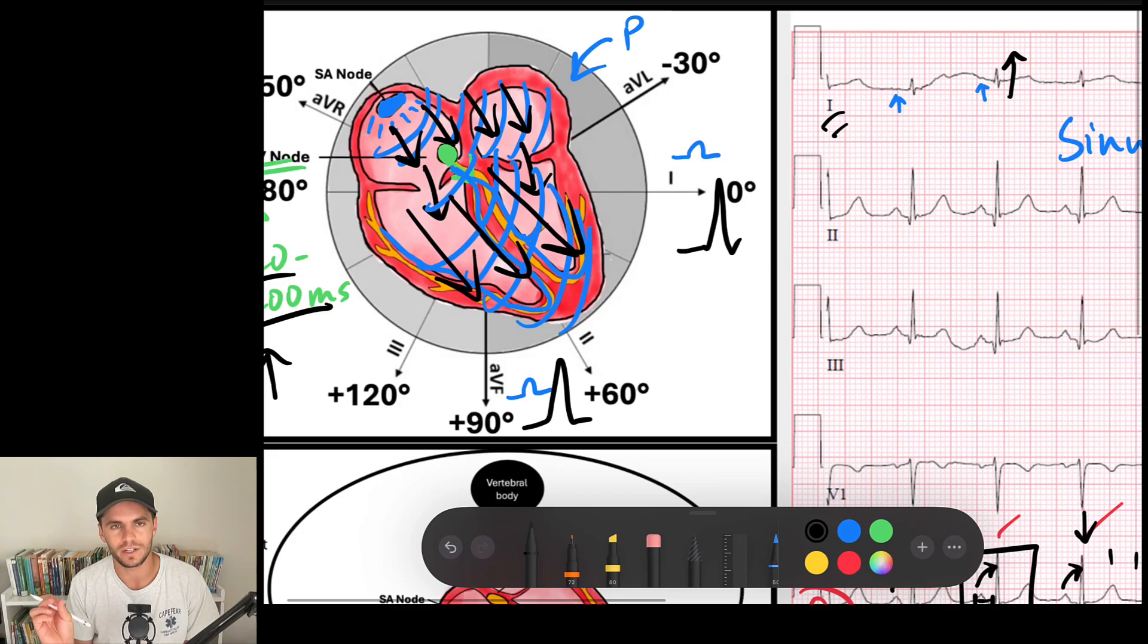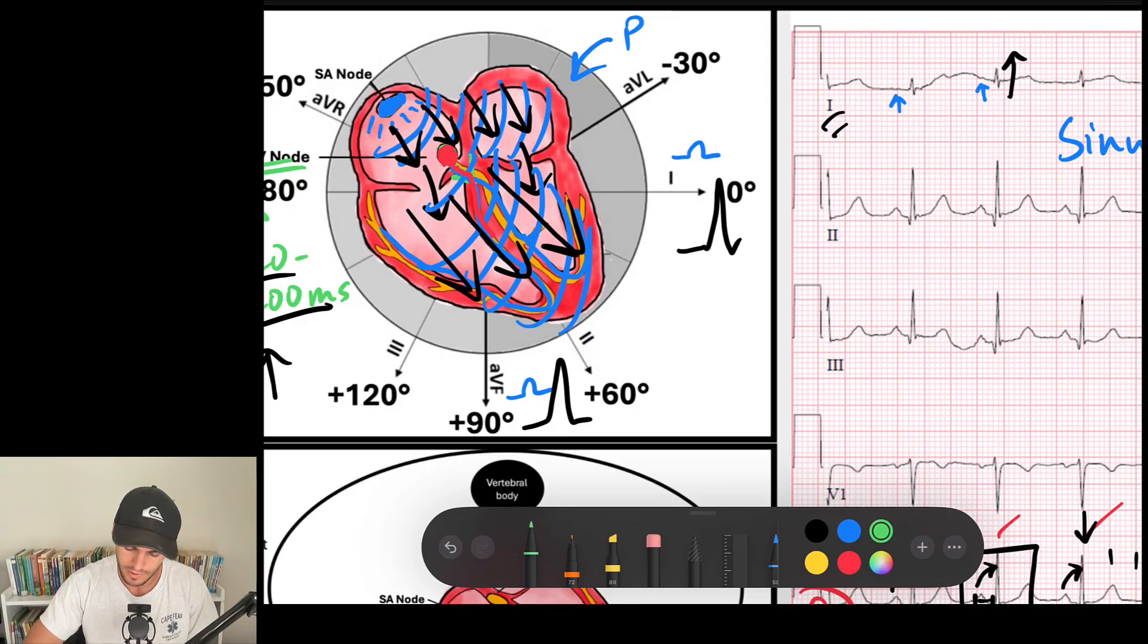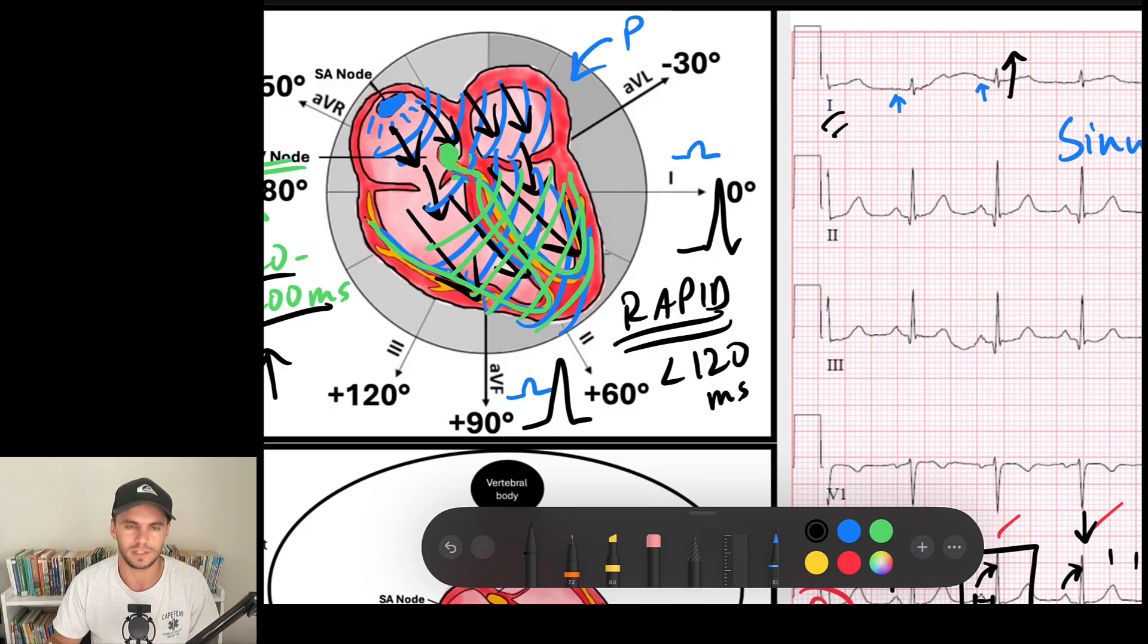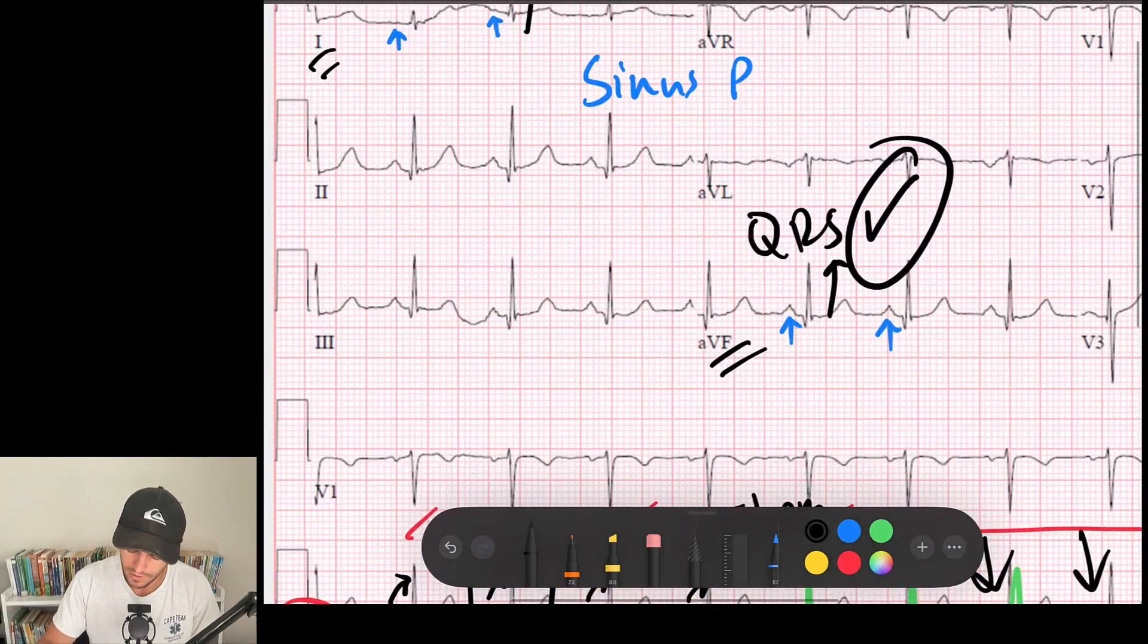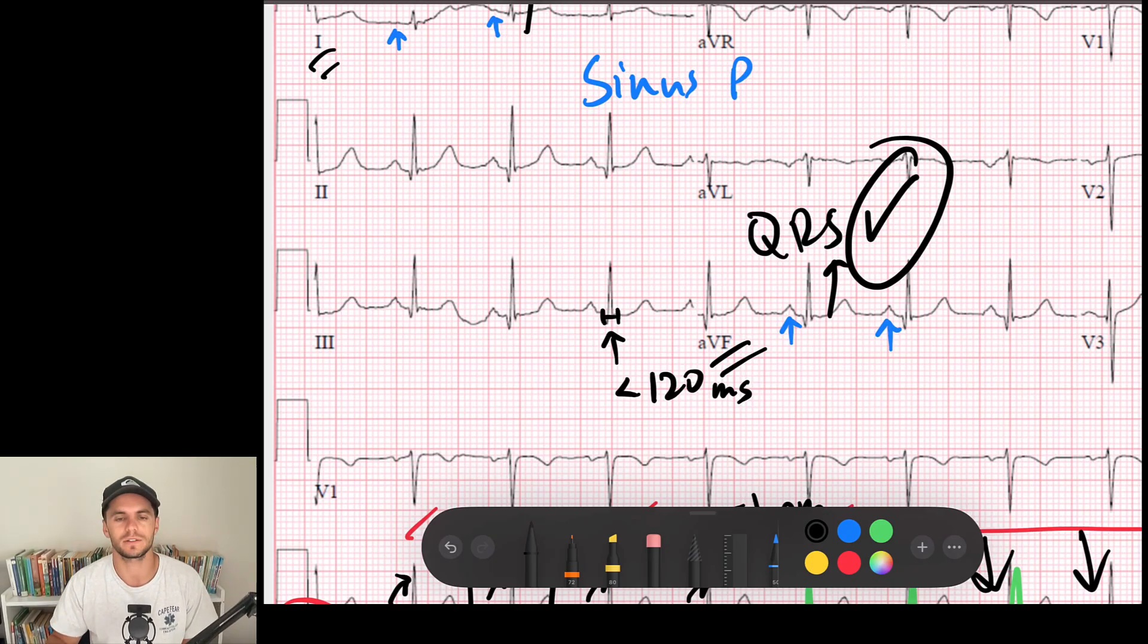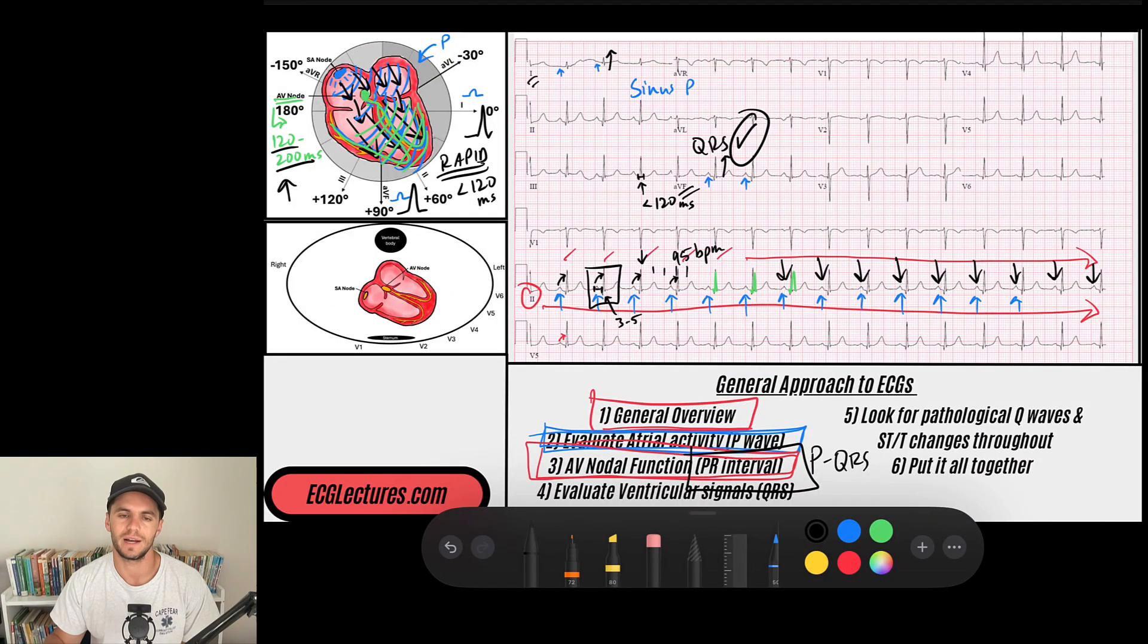The next thing I'm going to evaluate for is the duration. Is the QRS wide or narrow? And I do that because remember when the AV node passes signal down, it does so via these rapidly conducting His-Purkinje system. Let's do it in green. So my AV node sends it down via the bundle of His and these Purkinje fibers that are the bundle branches. And remember, those are specialty fibers that conduct signal very rapidly. And we know that rapid signal means the QRS should be less than 120 milliseconds or less than three small boxes. So I look at the duration of my QRS, and I look here, and I see that my QRS is less than 120 milliseconds or less than three small boxes. And that tells me that signal is traveling through those His-Purkinje fibers the way they should.